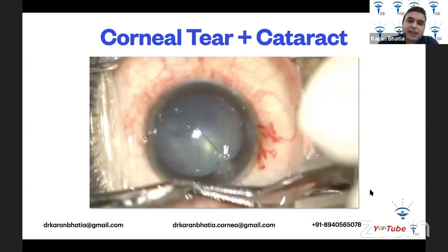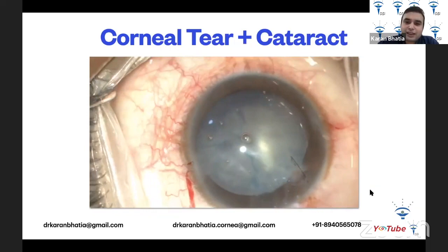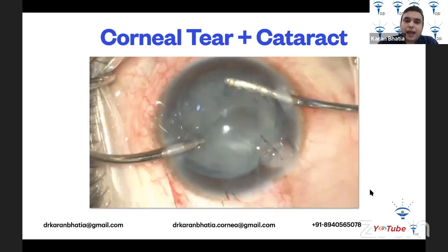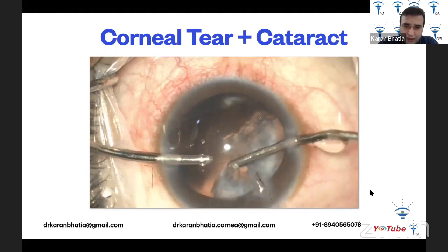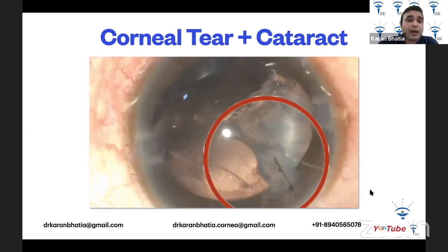This surgical case shows a corneal tear with cataract. Since it was a very small tear, the approach is to stain with trypan blue so you can see the capsule edges nicely. Then the corneal tear can be repaired — only one suture was required. The anterior capsular tear is then converted into a rhexis, and irrigation-aspiration is performed. These traumatic lenses are very soft, so aspiration alone is often enough.